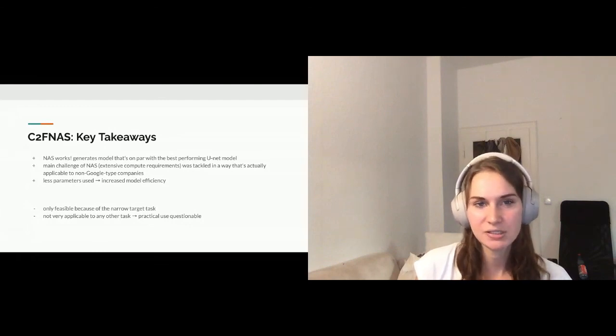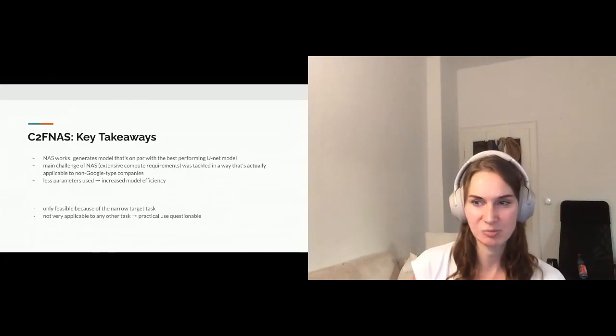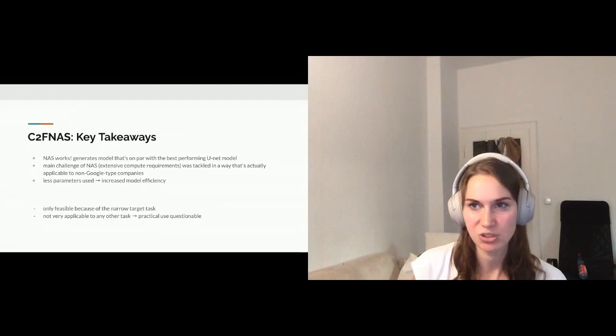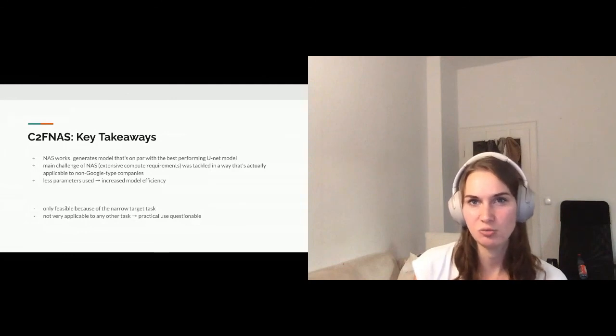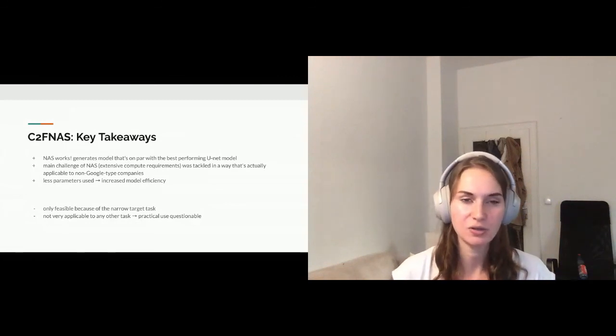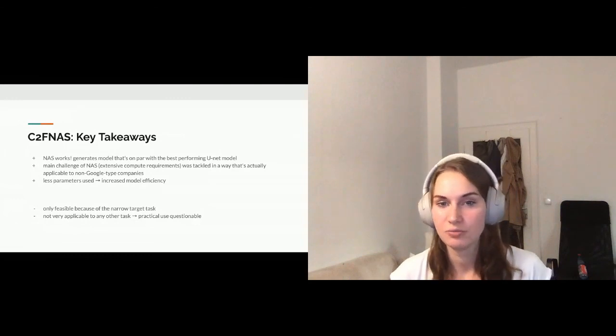On the other hand, I definitely want to mention that this is only feasible because they defined a very narrow target task. So the way they set up their framework, it's only applicable to medical image segmentation. Maybe some other segmentation tasks, but even that I wouldn't be too sure about, and whether it would work on natural image segmentation tasks as well. And that again makes the practical use a little bit questionable, because given that they had to put so much human expertise and human knowledge into designing this task, into designing the way the neural architecture search works, it's questionable whether this could generalize onto anything, or whether this actually has a good practical use.